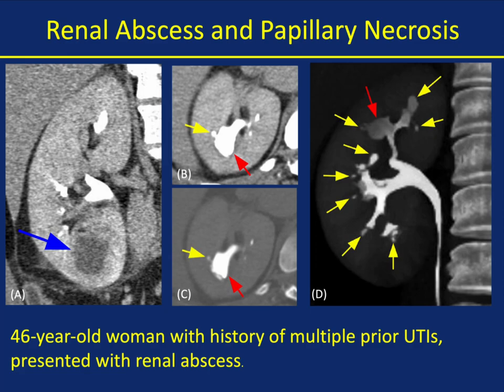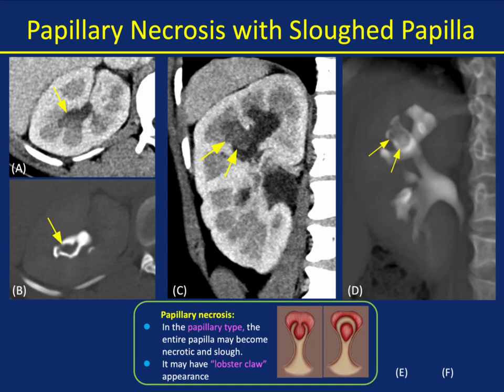Here's a patient with a history of prior UTIs who presented with a renal abscess, but you can see multiple areas of papillary necrosis involving multiple calyces. Wide windows allow you to see it, and the MIP imaging is particularly good. You also see irregularity and narrowing of the upper pole calyx. You have to be careful — sometimes papillary necrosis can look in many ways similar to an infiltrating transitional cell carcinoma. Another case of papillary necrosis with a sloughed papilla — this is that lobster claw appearance, very nicely shown on the MIP imaging, where the entire papilla is worn away.